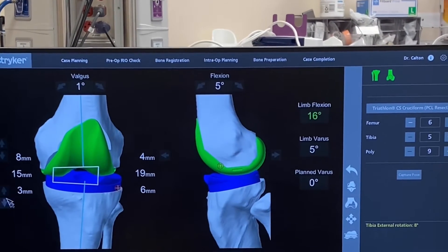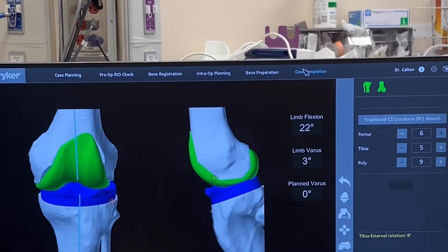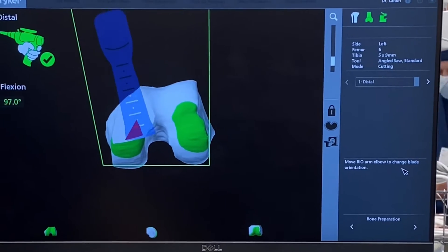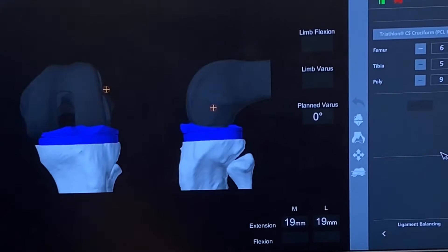Do you want me to go up on the tibia or down on the femur? Okay. So it's coming in here, comes out here — you go, you're good right now.